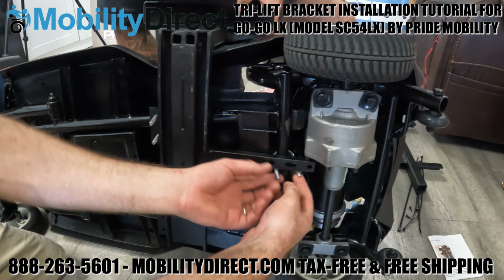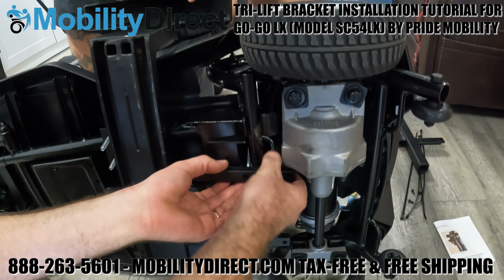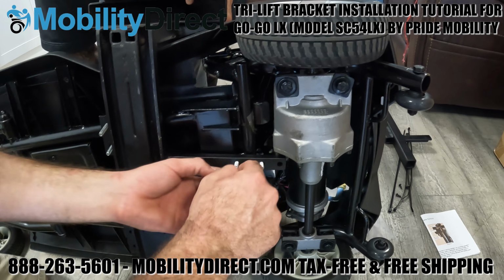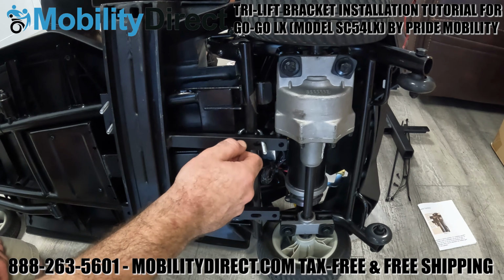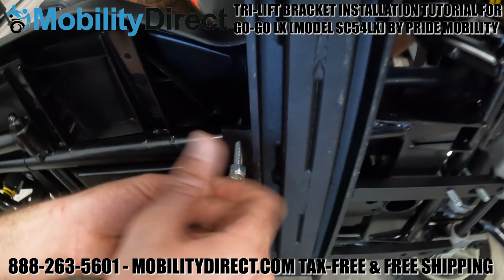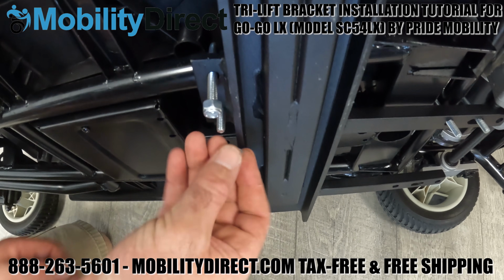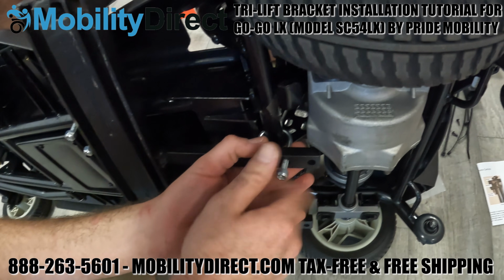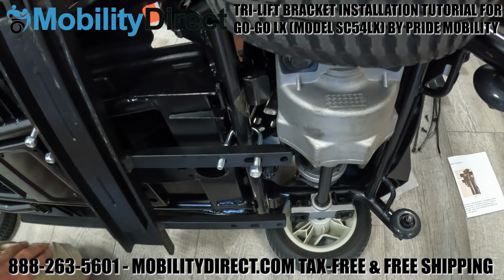That's why you see the big triangle bracket at the very top there on top of the scooter, which would be on the left side if it was sitting up on its wheels. So take notice of how we're installing these U-bolt hooks, because this is the exact layout that you'll need to use if you have the GoGo LX four-wheel and you want to install the tri-lift bracket to it as well.